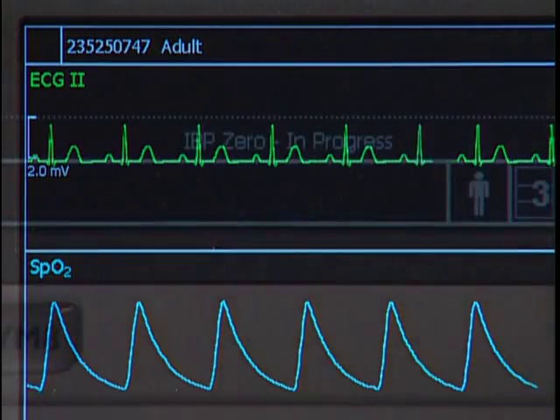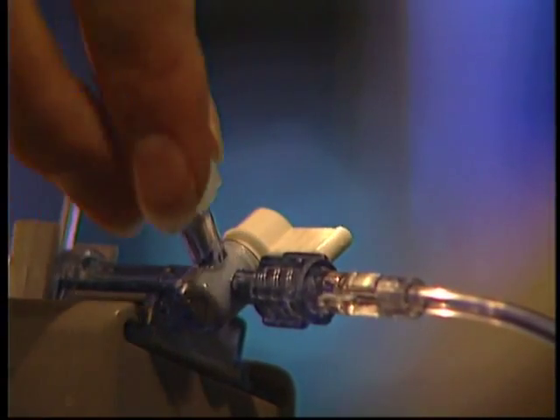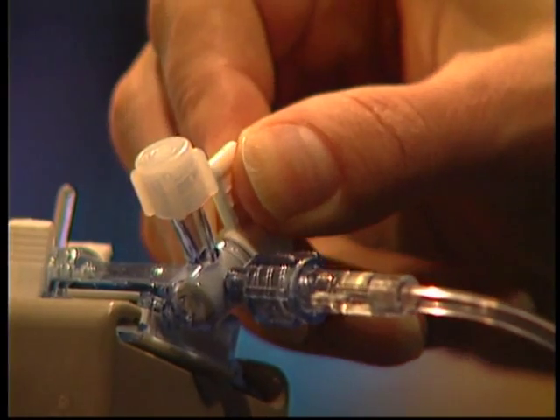The IBP waveform menu closes and the message IBP zero in progress appears in the IBP waveform pane. When you see IBP zero complete, close the stopcock to atmosphere and open the stopcock to the patient.